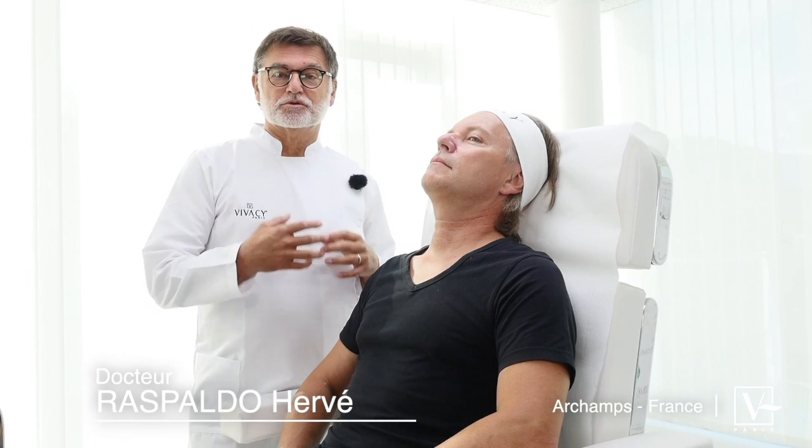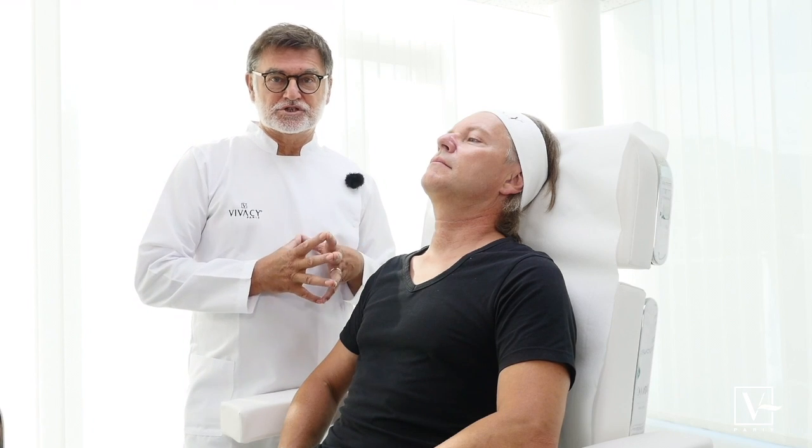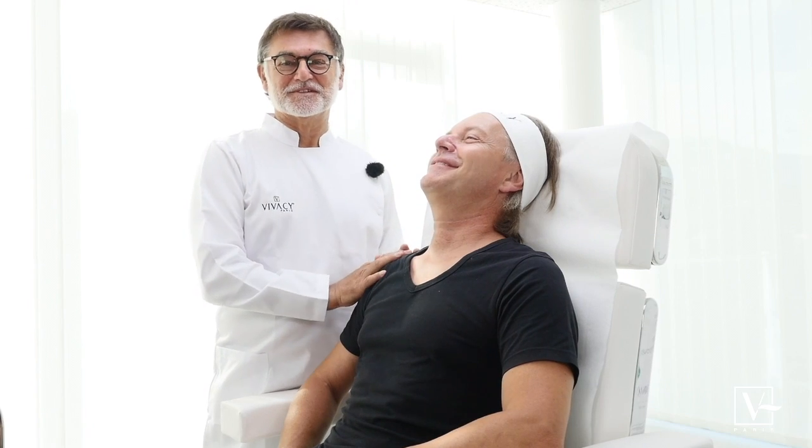We're going to show you how we manage to inject males with the Stylage range. So we have Dan. How old are you, Dan? 56. You look younger than 56, honestly.